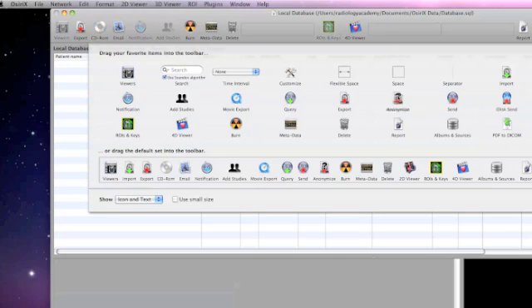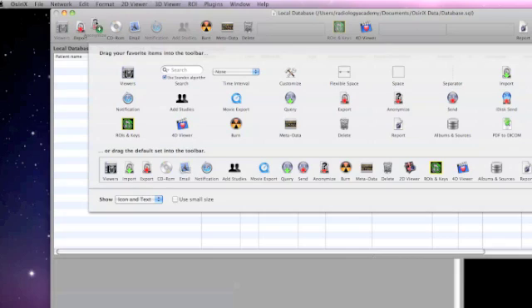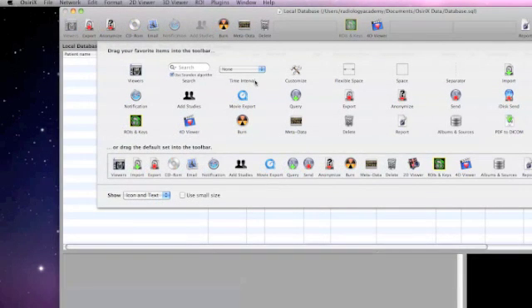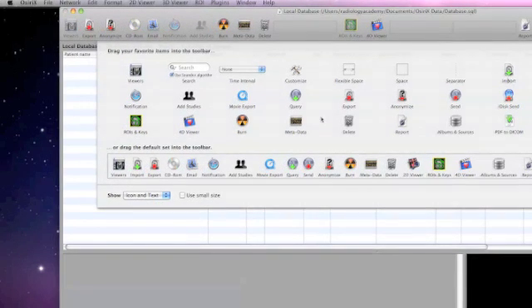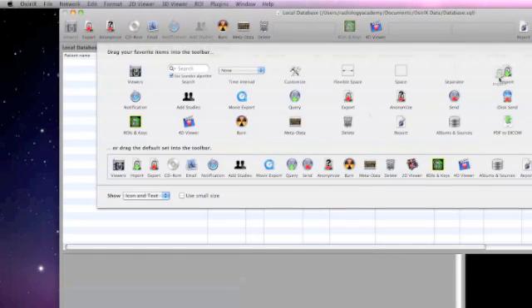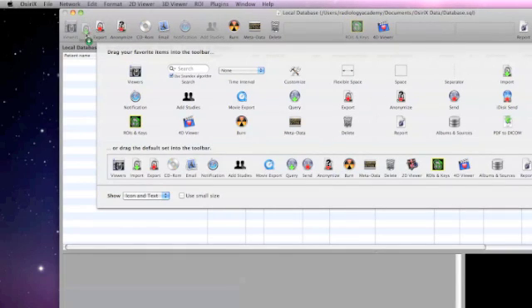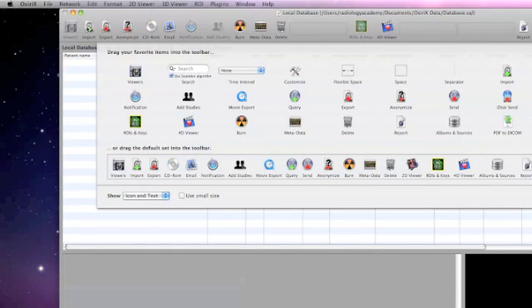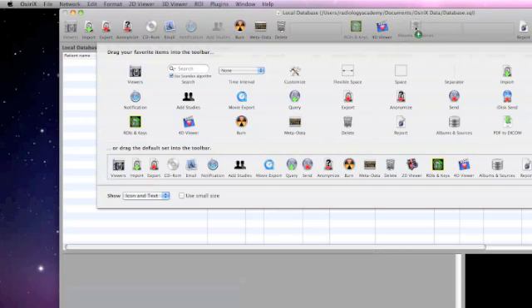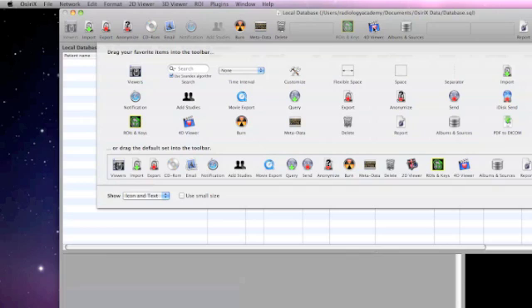Particularly important tools include the Anonymize function, which allows us to remove the patient name and other important identifying data. We can add the Import function to import files from the database, and other important functions such as the Album and Source folder.